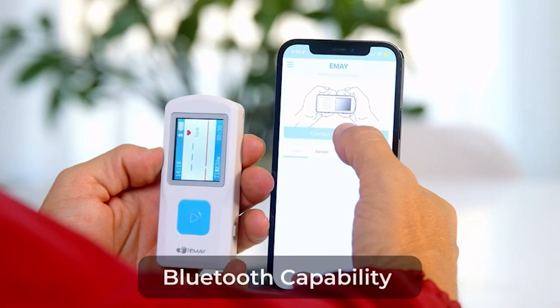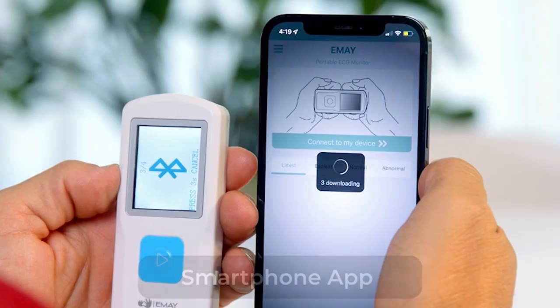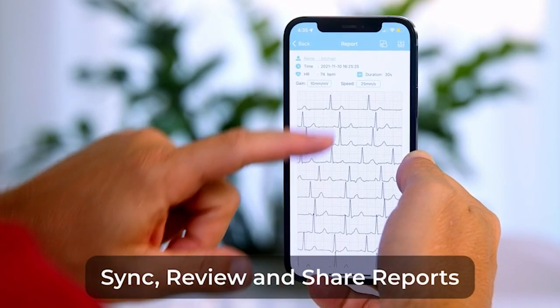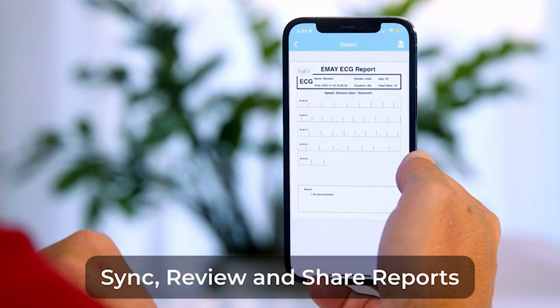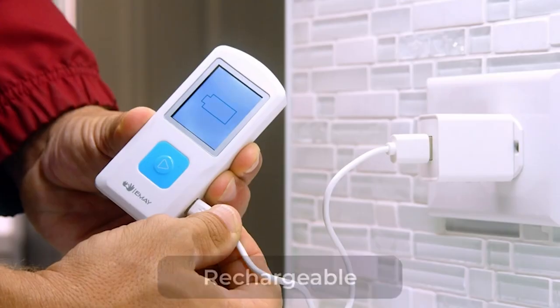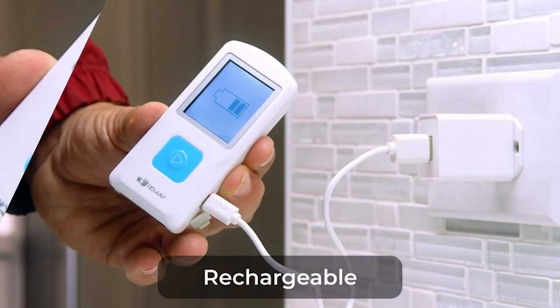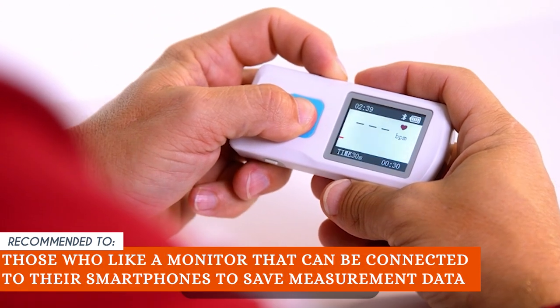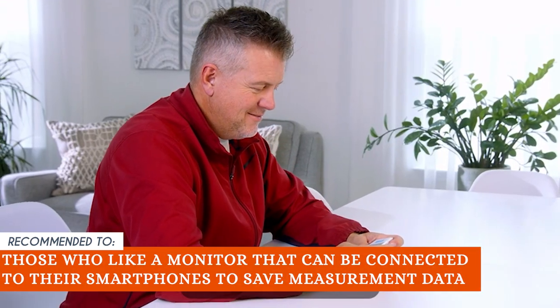Regardless of being the best monitor on our list, it still has its limitations. One of them is that downloading the app to a cell phone is a bit difficult if you're not well-versed in the process, but once downloaded and set up, the phone and PC apps seem convenient and relatively easy to use. The Trusted Shopping Guy team recommends this to those who like a monitor that can be connected to their smartphones to save measurement data.